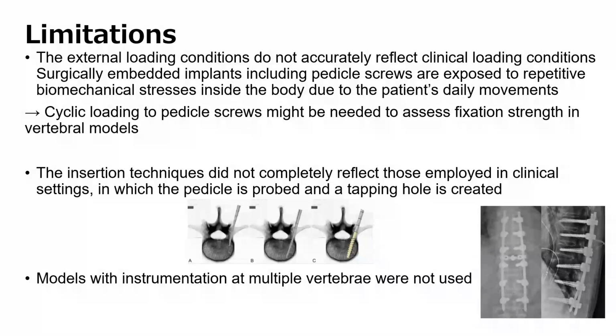First, the external loading conditions do not accurately reflect clinical loading conditions. Surgically embedded implants including pedicle screws are exposed to repetitive biomechanical stresses inside the body due to the patient's daily movements. Therefore, cyclic loading to pedicle screws might be needed to assess fixation strength in vertebral models. Second, the insertion techniques did not completely reflect those employed in clinical settings, in which the pedicle is probed and a tapping hole is created. Finally, models with instrumentation at multiple vertebrae were not used.